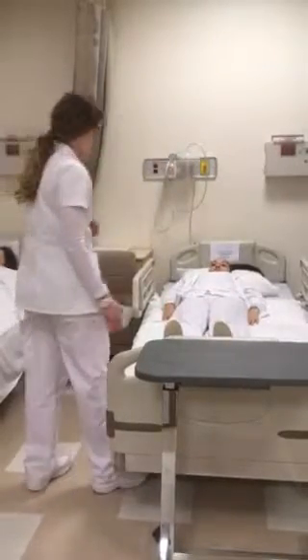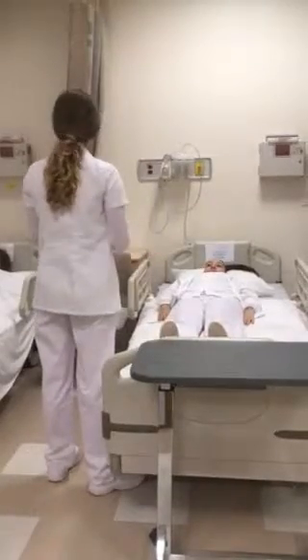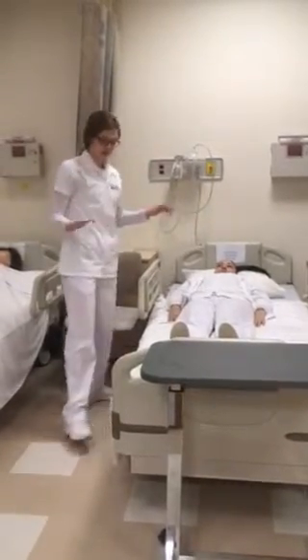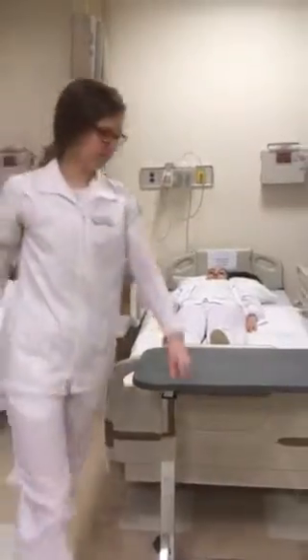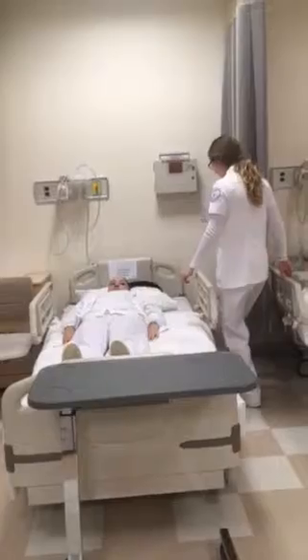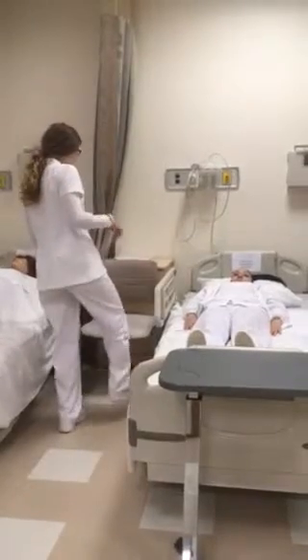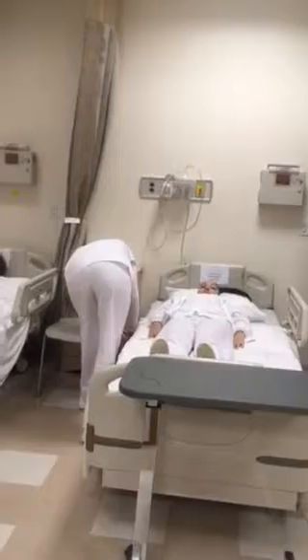So it seems that you have a little bit more weakness on your left side. So I am just going to put your wheelchair on your right side when we're moving you, okay? Alright. So the next thing that I want to do is make sure that they're safe. So I'm going to lock the bed into place on all 4 sides. Lock, lock, and of course you're going to want to lock the wheelchair. Lock, lock.